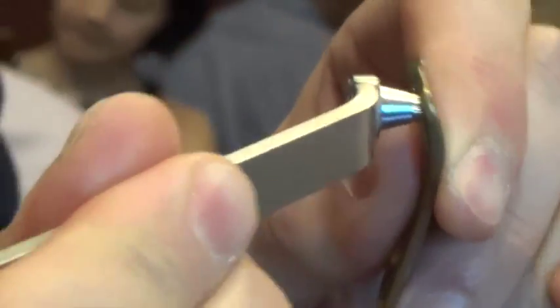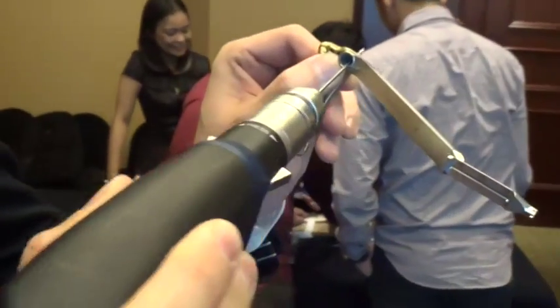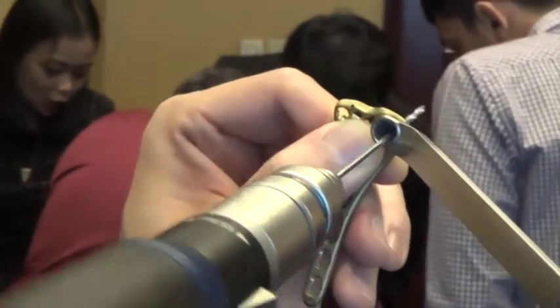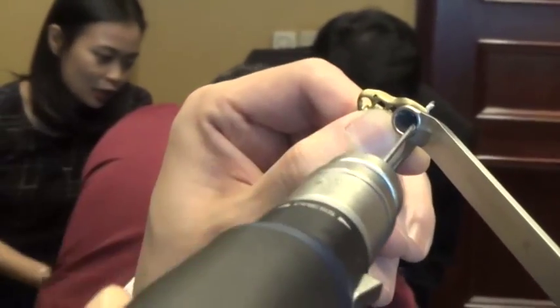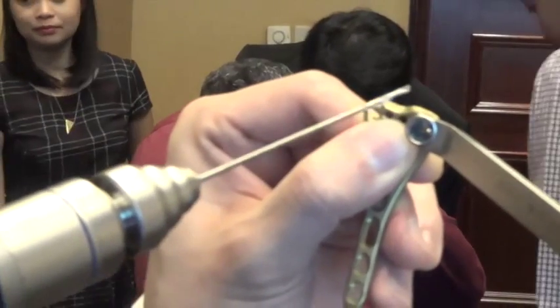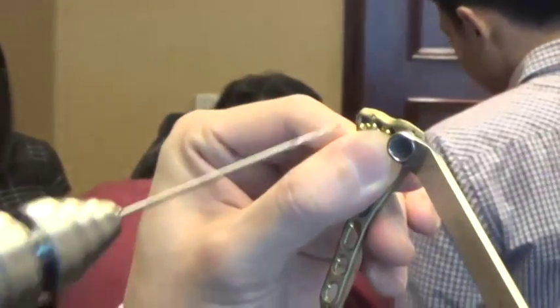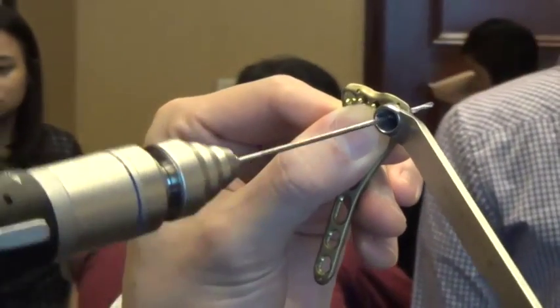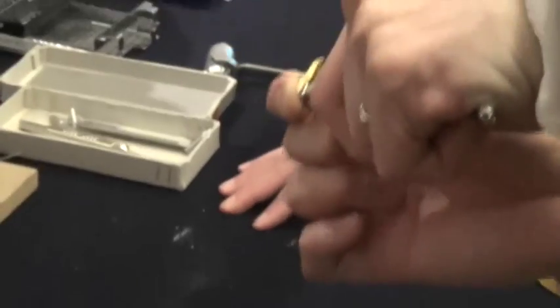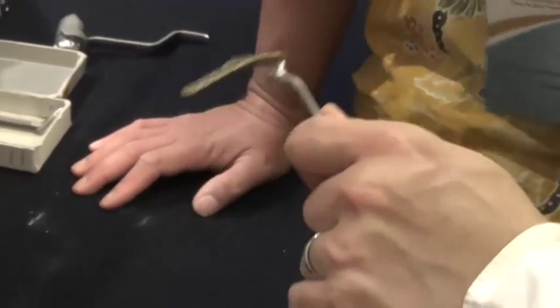The placement of the drill sleeve has to be fixed perfectly into the groove such that it sits rigidly onto the plate. The drill is placed in the hole, and you drill a variable angle screw by angling the drill bit according to the direction that you want. This part of the drill guide sits rigidly onto the plate like so, and only the drill bit moves around the variable angle hole. It's only fixing one direction.